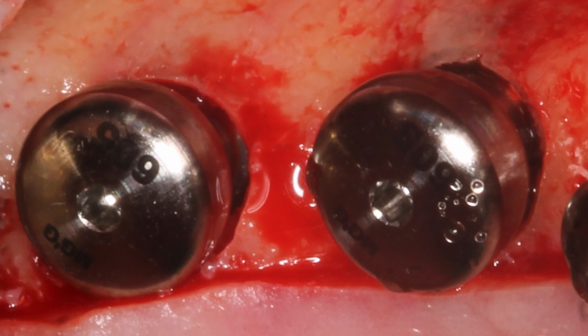If, hypothetically, the healing abutment was touching the bone, we have several unwanted consequences. Number one, the healing abutment may not engage fully because that piece of the bone might be resisting.